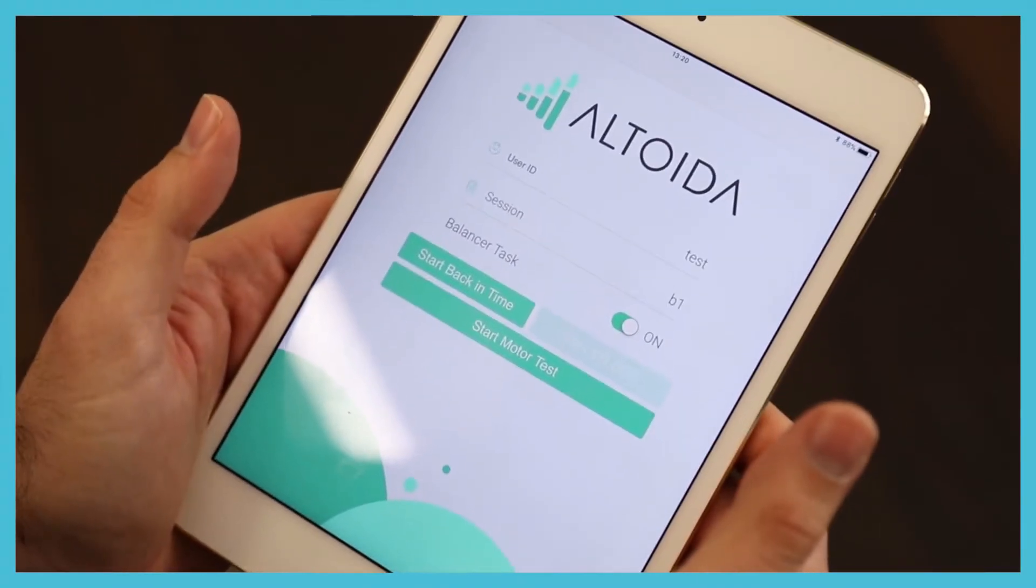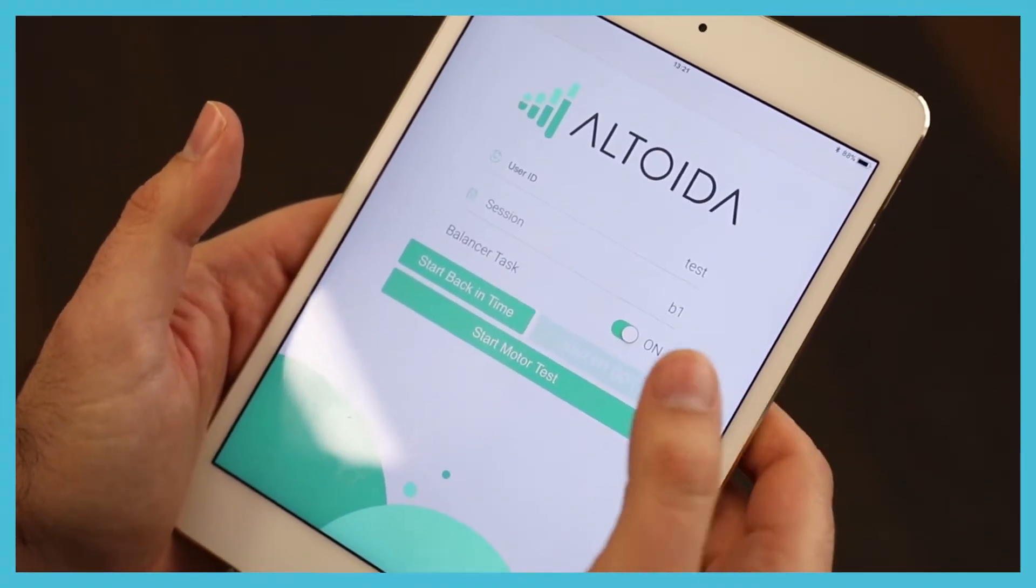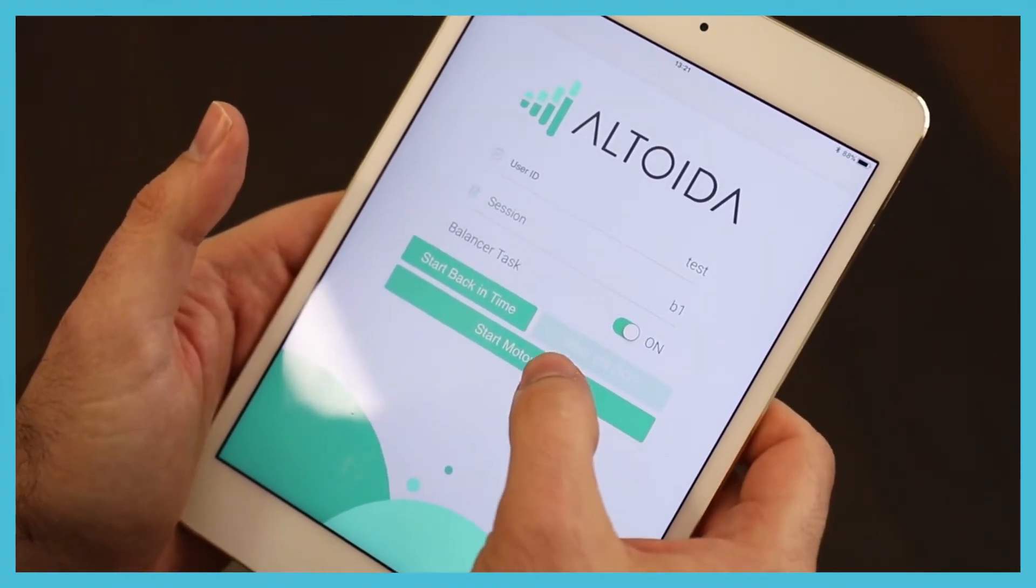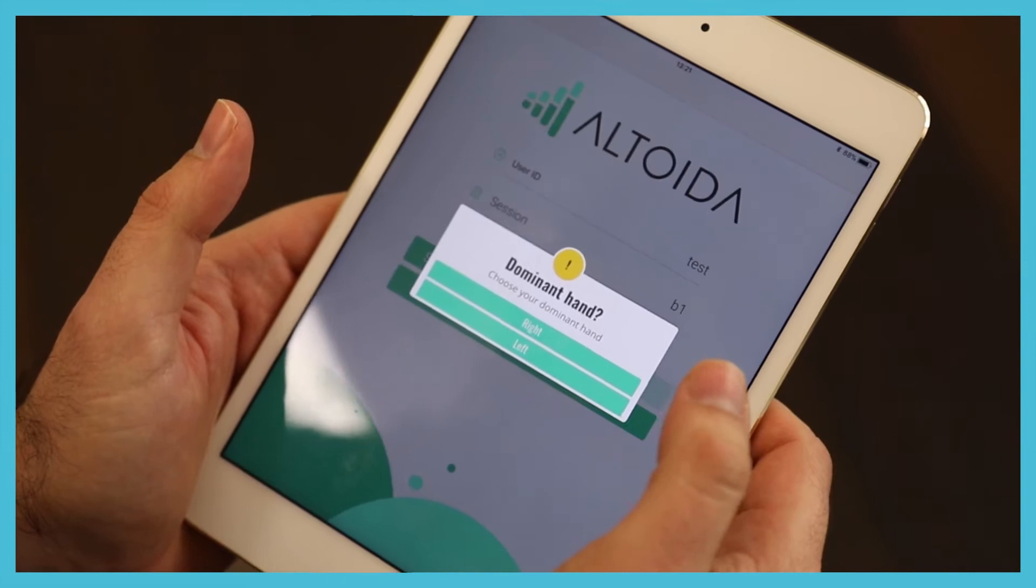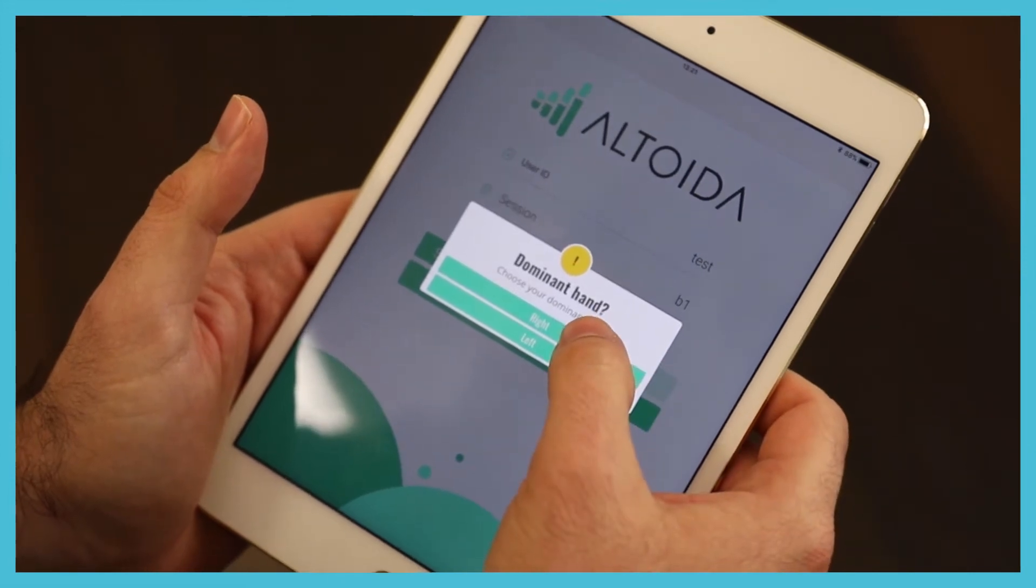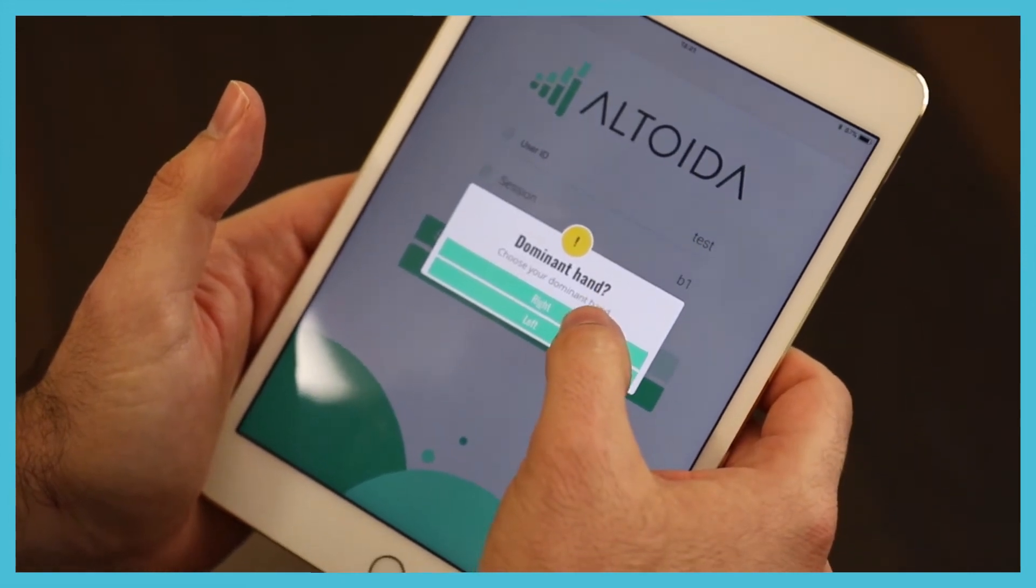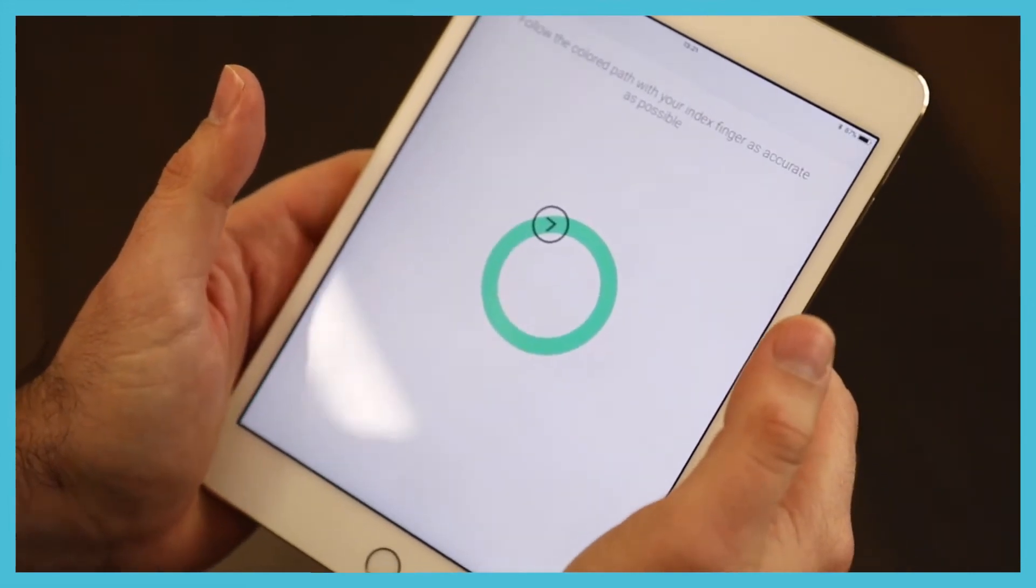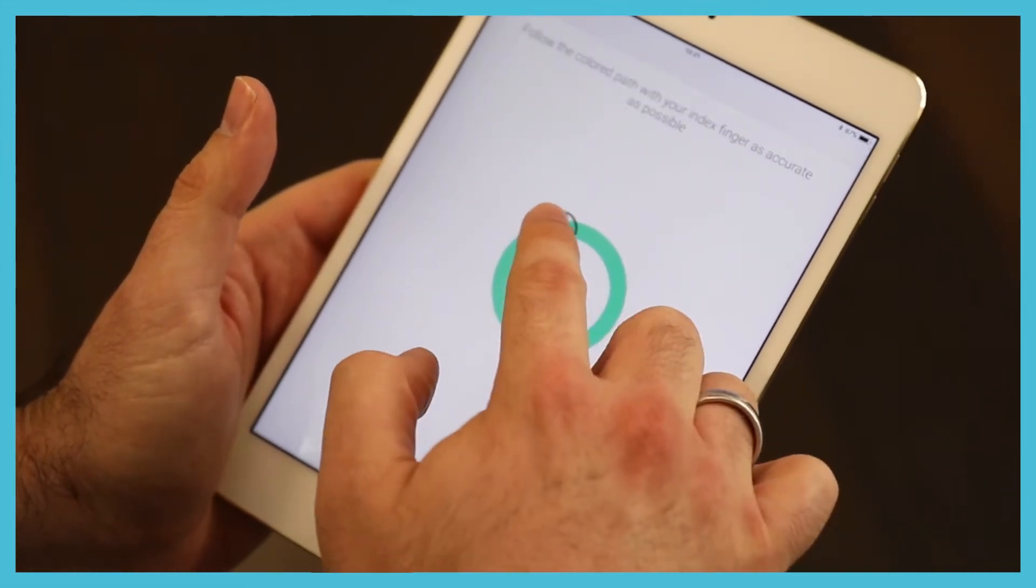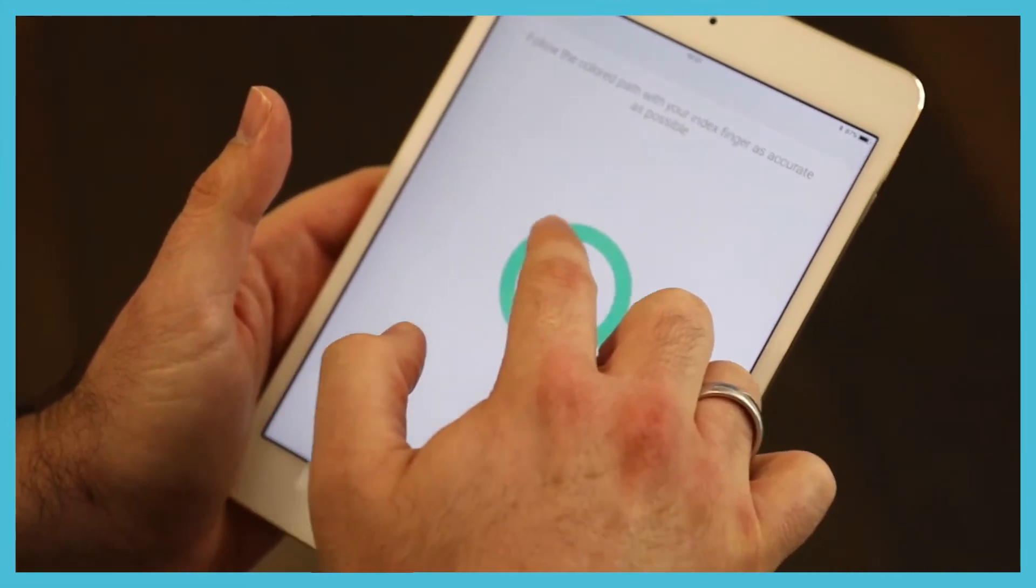This is how the Altoida test looks like. You start by doing a motor test, you select your dominant hand, then you just follow the instructions.